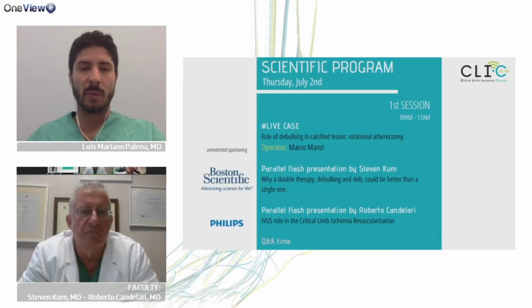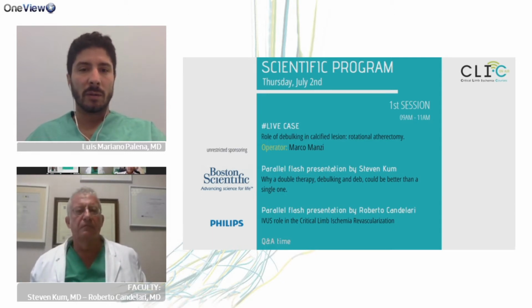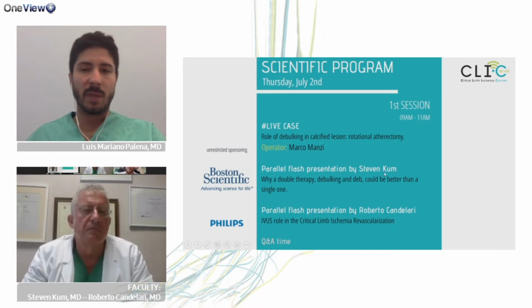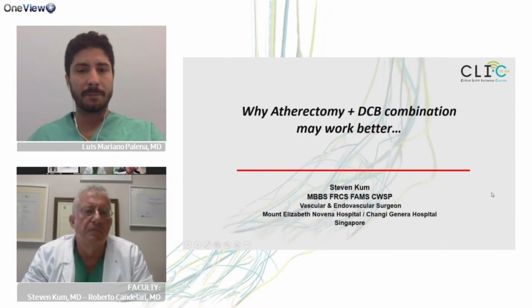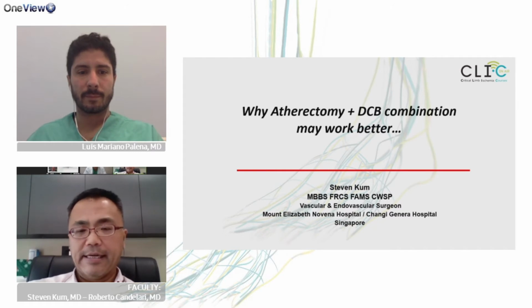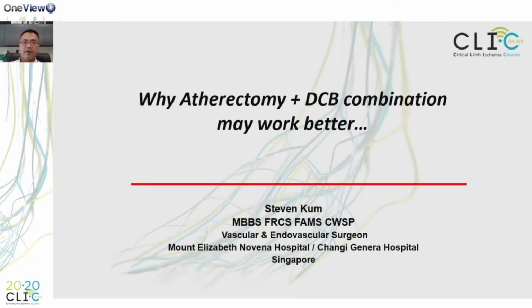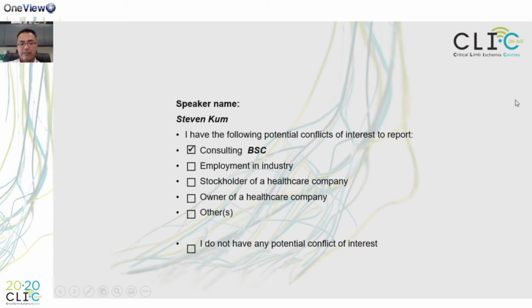So let me give space for the next presenter, Steven Kum from Singapore, who will talk about double therapy, whether debulking and DCB could be better than a single one. Thank you, Mariano, and sorry to take everybody away from the live case, but it's really an exciting case, a beautiful demonstration of CO2. So my task today is to give you an idea of whether atherectomy and drug-coated balloon combination may work better than just single.